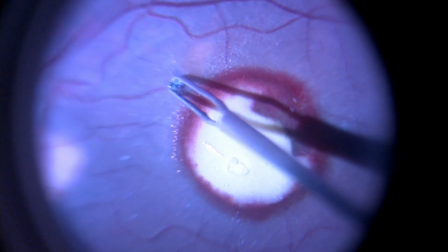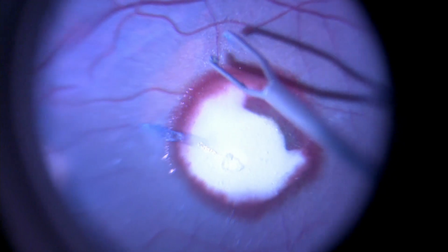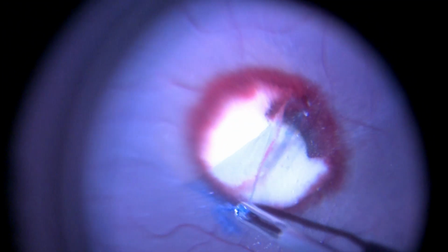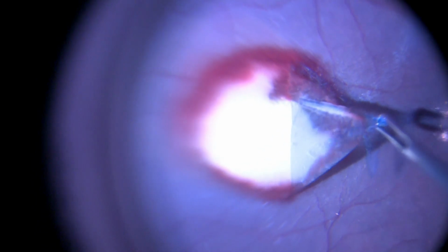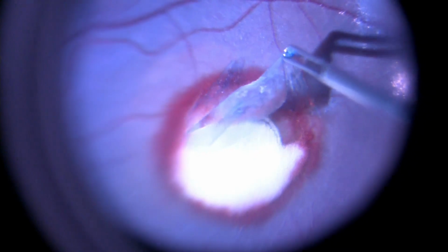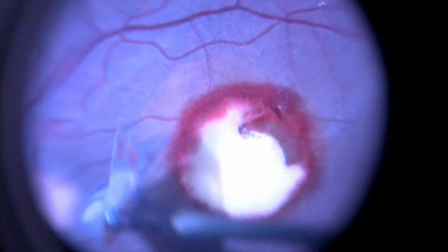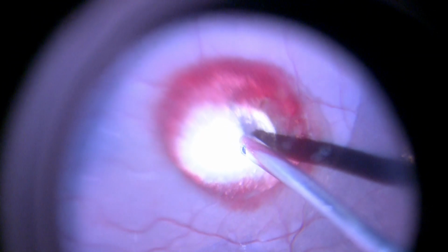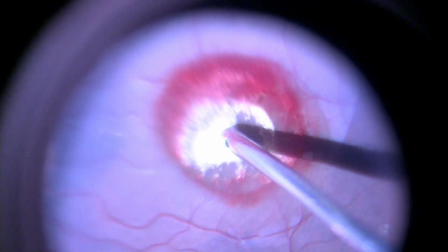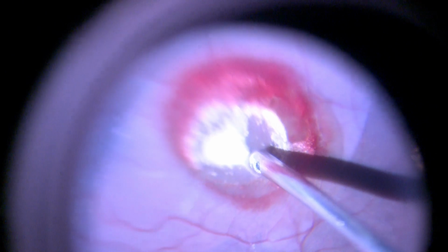The peeling was carried out under high magnification. This gave free access to the trapped hemorrhage. The blood was then gradually aspirated with the cutter.